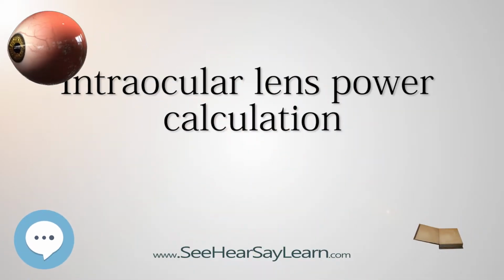The aim of an accurate intraocular lens power calculation is to provide an intraocular lens, IOL, that fits the specific needs and desires of the individual patient. The development of better instrumentation for measuring the eye's axial length, AL, and the use of more precise mathematical formulas to perform the appropriate calculations have significantly improved the accuracy with which the surgeon determines the IOL power.